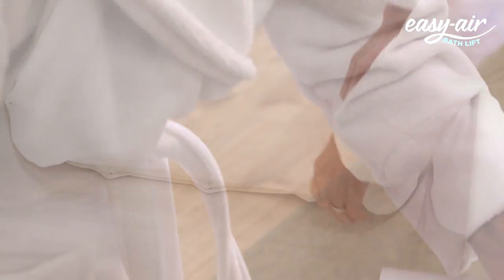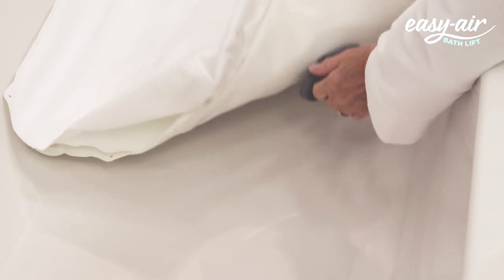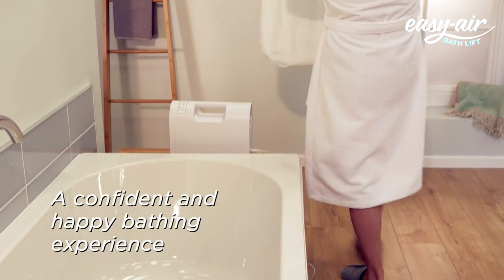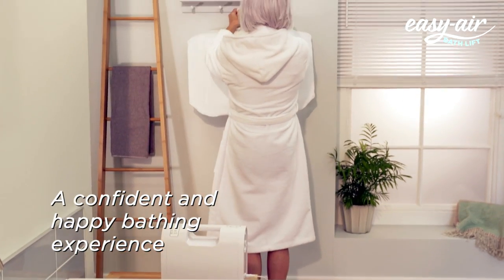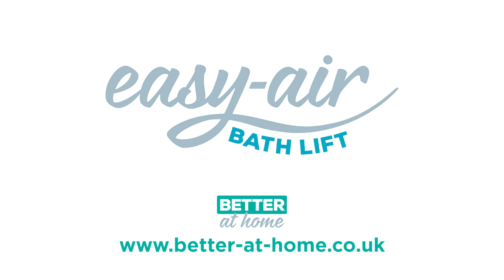Simply disconnect the hose from the compressor and let the bath lift deflate. The Easy Air Bath Lift is as easy to pack away as it is to set up, so there are no issues for other bathroom users. We help those with impaired mobility maintain their independence. It's always better at home.